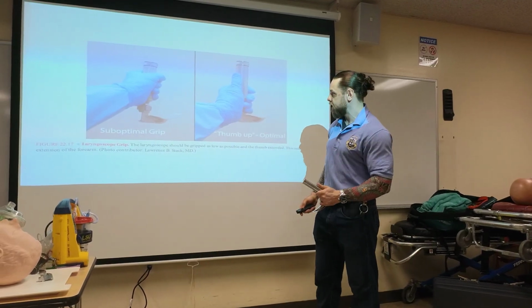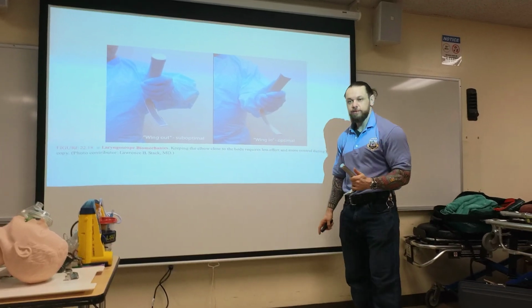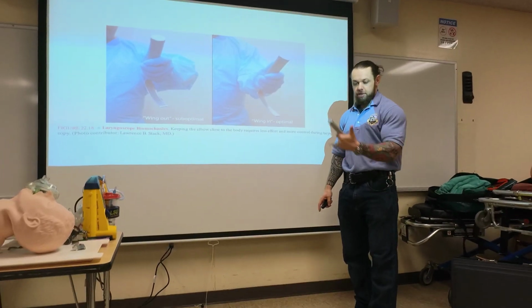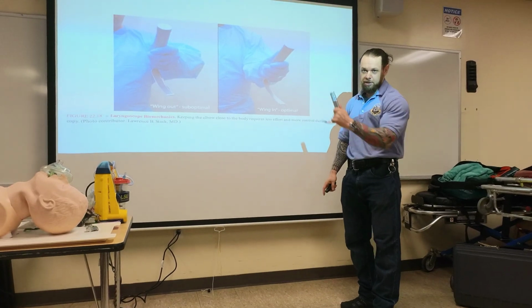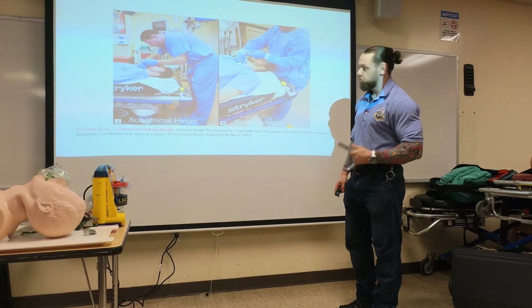You're going to give me thumbs up, and then your chicken wing. You see how the arm is out? You're going to put your chicken wing in. This gives you better leverage. So thumbs up, chicken wing in, and you're going to give me the Rock'em Sock'em motion. Everybody follow? All right.